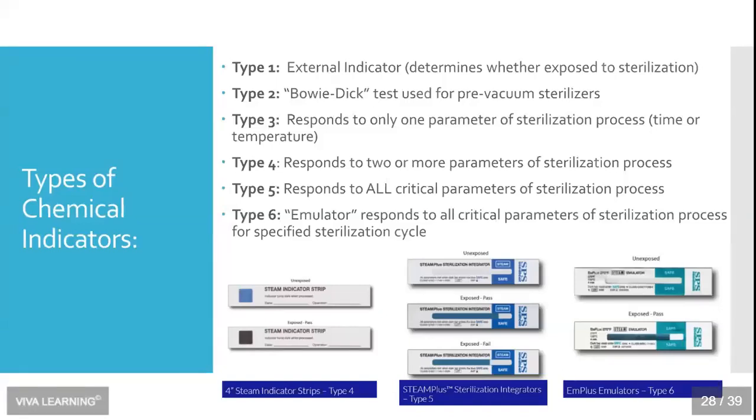And for my Canadian colleagues who are on this call with me, especially those of you who practice in Ontario, you have specific requirements on which type to use and when, and your guidelines have an exact flow chart on how and when to use these specific types of chemical indicators. In the United States, we're not there yet. That time may be coming in dentistry. Our medical colleagues, of course, do use these different types of chemical indicators.